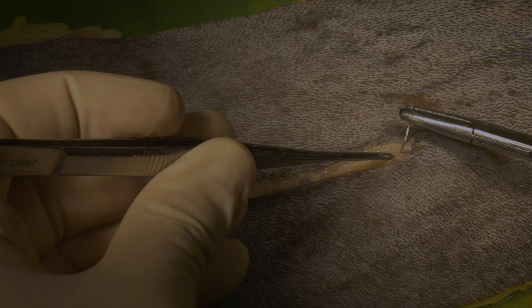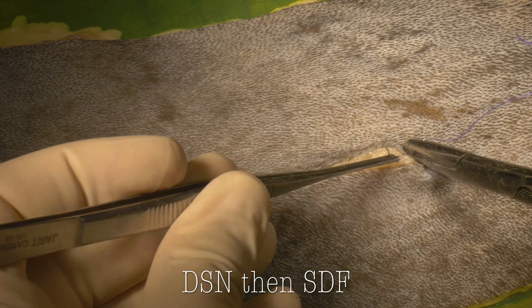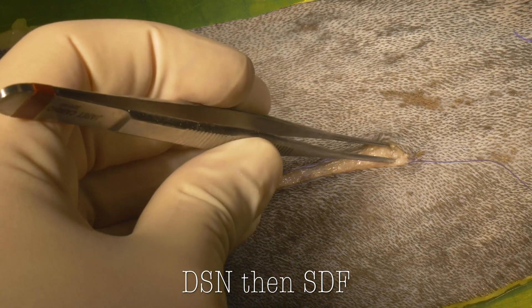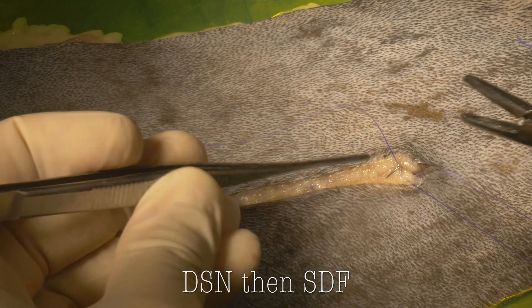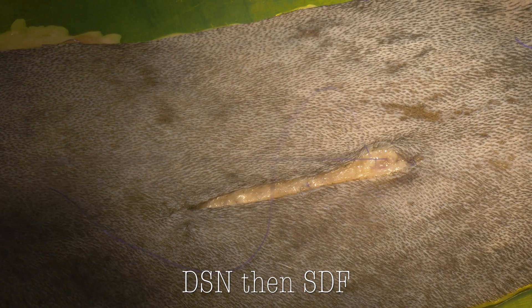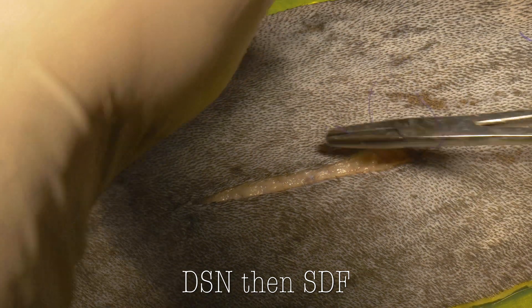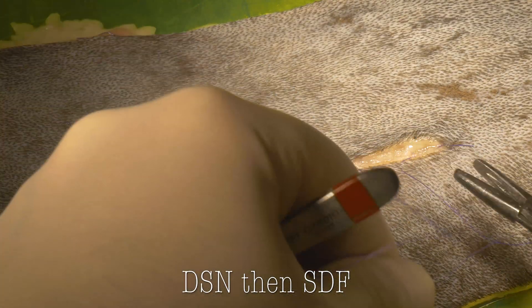Since an intradermal closure is not a holding layer, an additional way to start this is by using a subcutaneous buried knot. With all buried knots, we'll start on the near side deep to superficial, or DSN — deep to superficial near — and then the far side, superficial to deep far. Making sure that both suture ends are coming out into the remainder of our incision. We'll then tie a square knot with four throws, putting tension parallel to the incision line in order to have the knot buried deeper in the subcutaneous tissue.